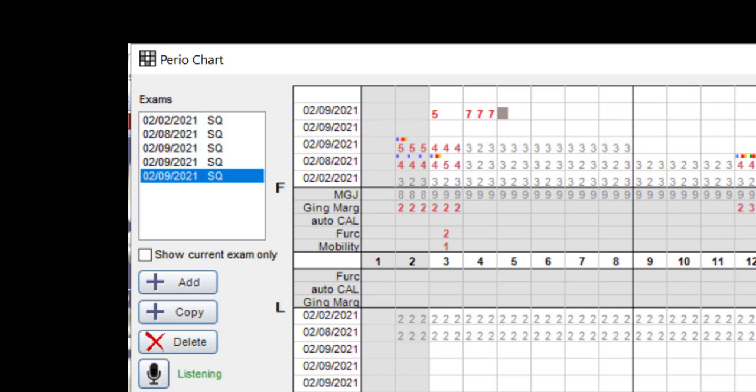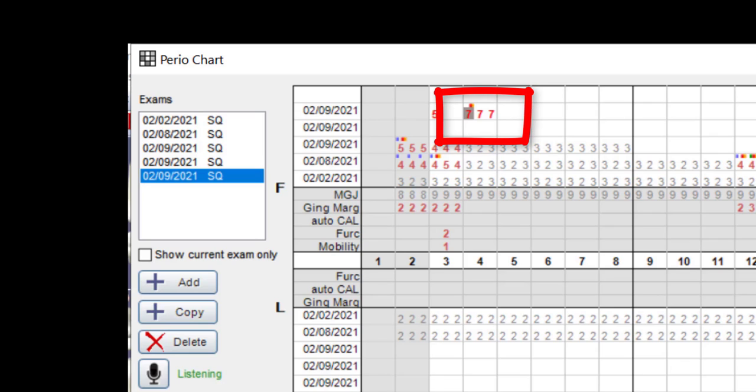Additional features include charting probing mesial, distal, facial, and lingual pocket depths, as well as charting bleeding, calculus, suppuration, plaque, and attachment levels.